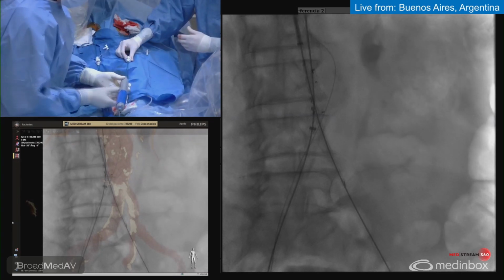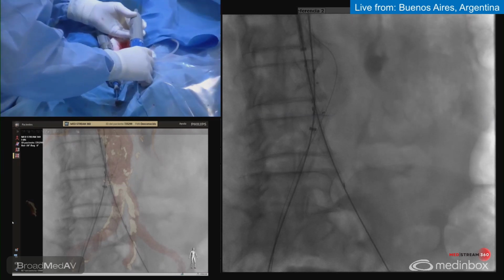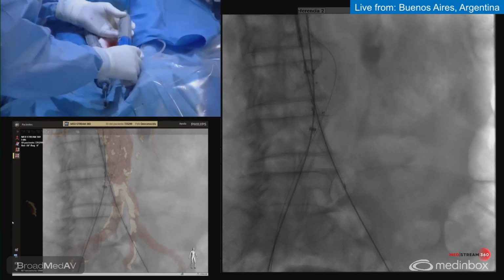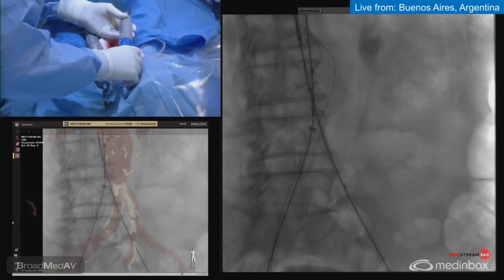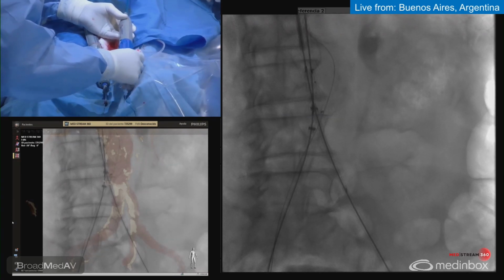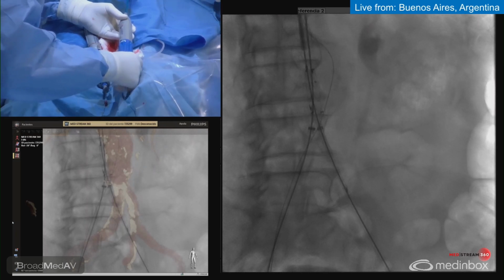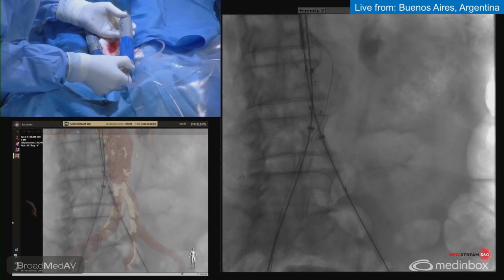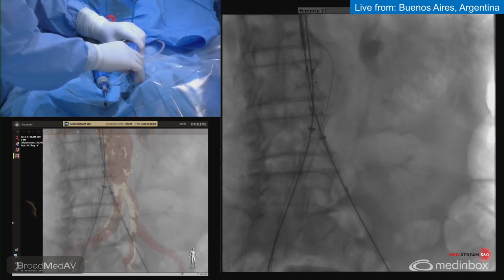So once again, hold it here. So I'm going to release here. You rotate, I'm going to rotate clockwise, release, as the other one. Okay, I'm going to keep there, trying to keep these markers together. Fabian is watching the proximal marks. I am watching the distal mark, trying not to go too low. Too low, exactly. So now I can release the proximal part. Is that okay? So I can open here. So I can release there.